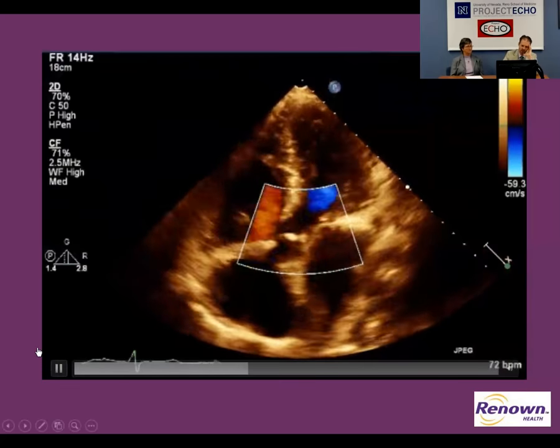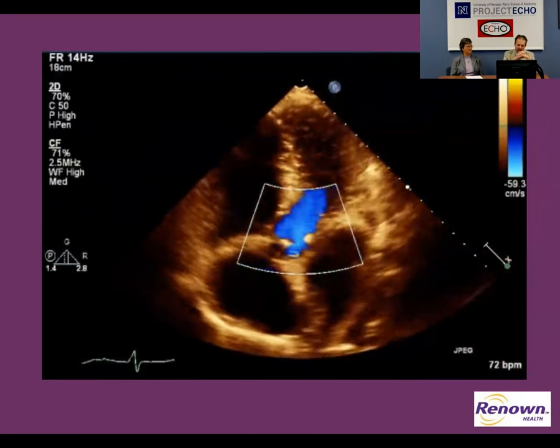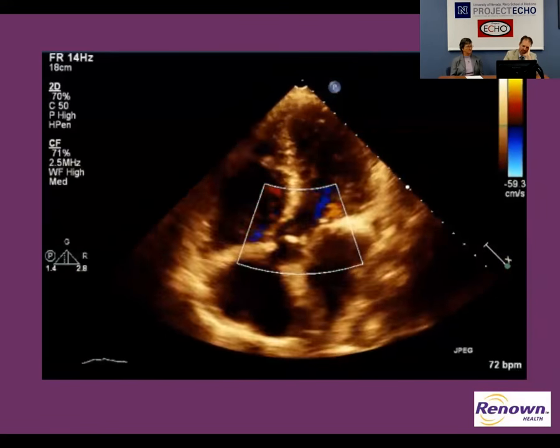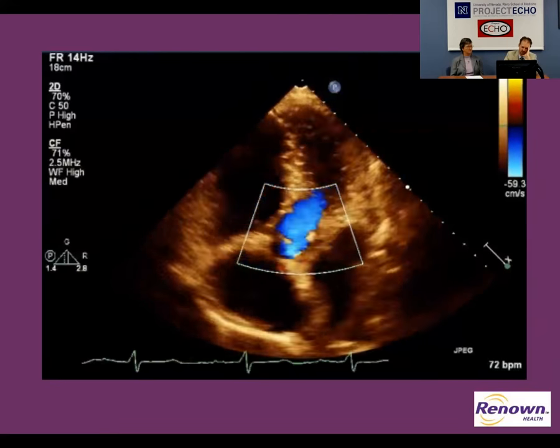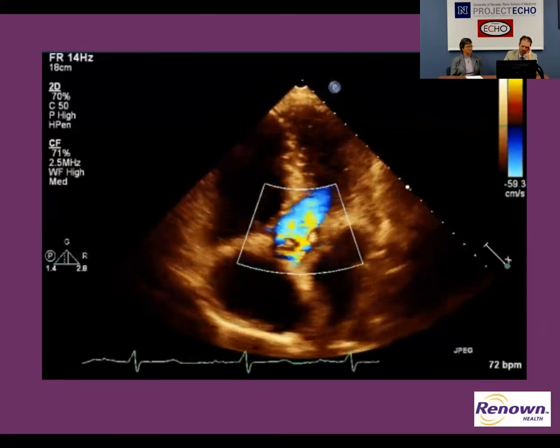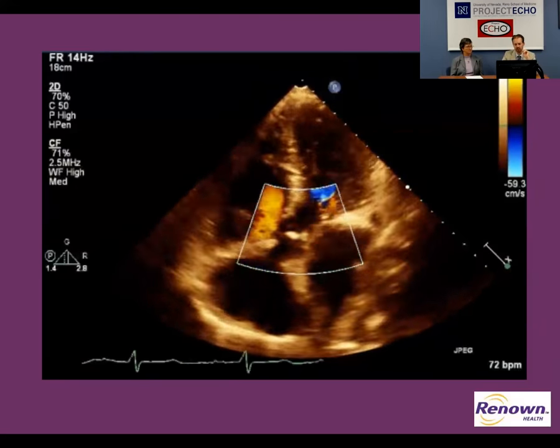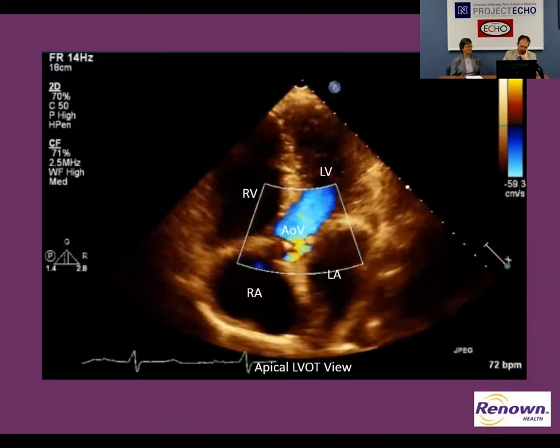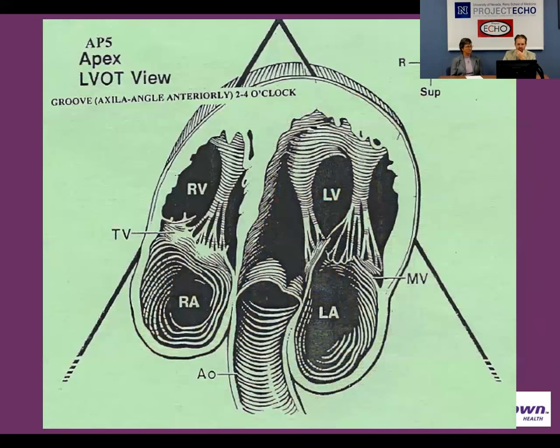And then again, you just put some Doppler flow on various valves, and you can see if those valves are regurgitant. There are some ways that you can tell, apart from just the leaflet opening, whether those valves are stenotic as well. But mostly we use Doppler flow hemodynamics to distinguish, especially a stenotic aortic valve, but also other valvular stenoses. We'll look at the gradients. Okay, so there you go.